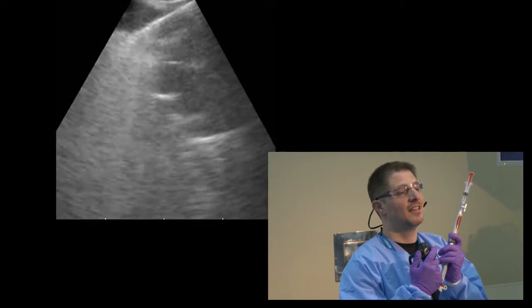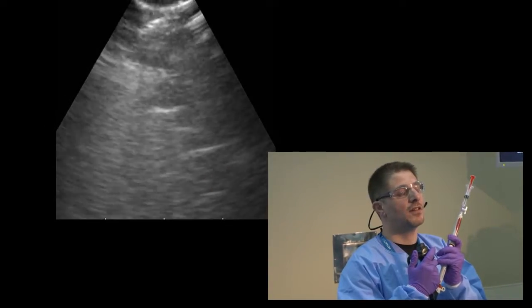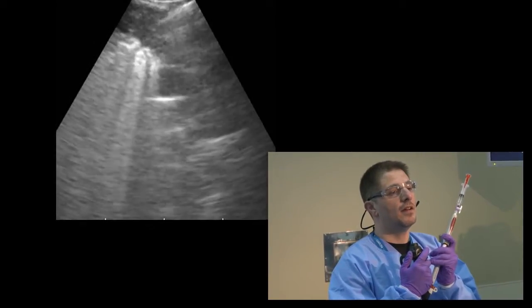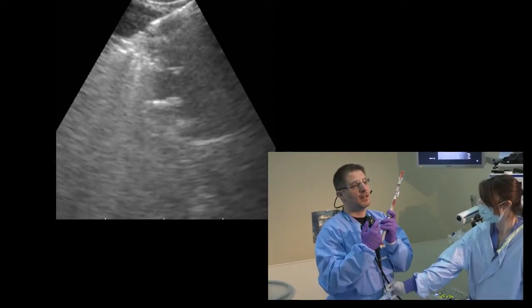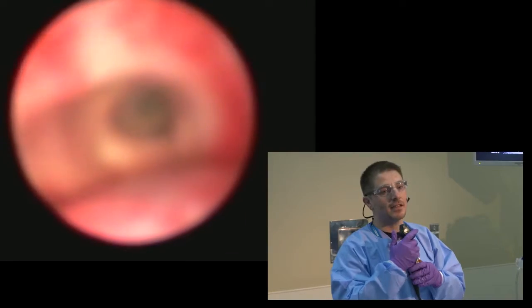Thank you. You asked to hold the scope in case your view is going with your hand motion and the needle is pushing away from the airway. So you achieve better contact between the ultrasound and the airway if somebody holds and stabilizes the scope for you at that location.